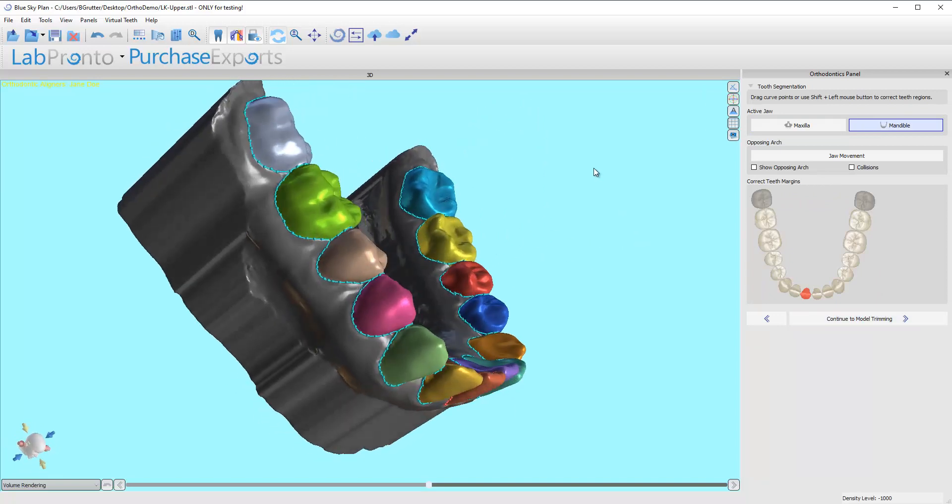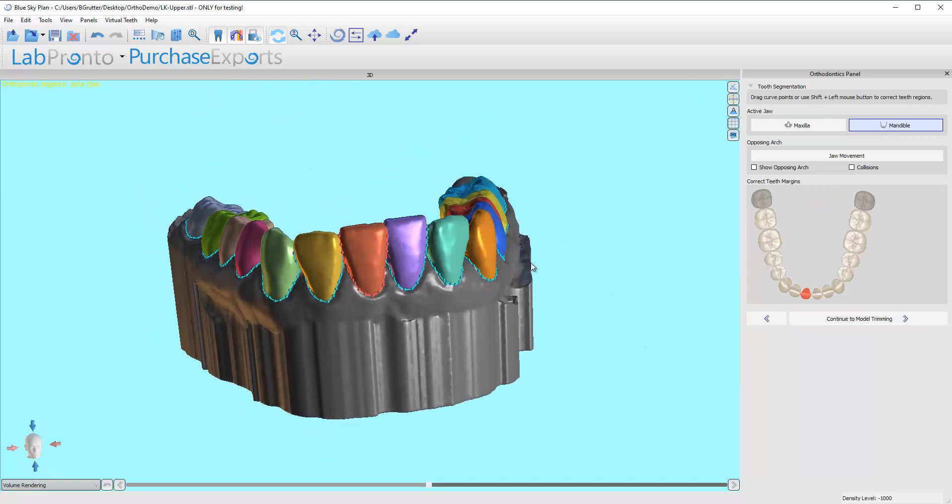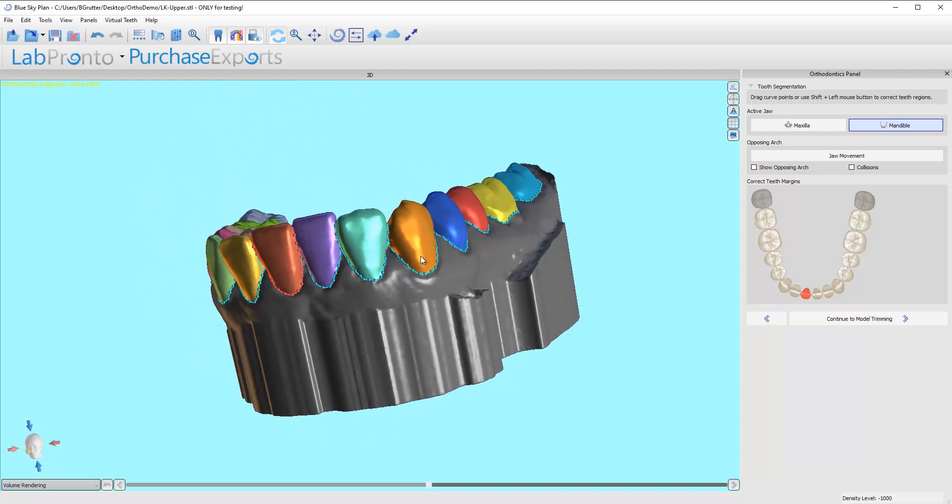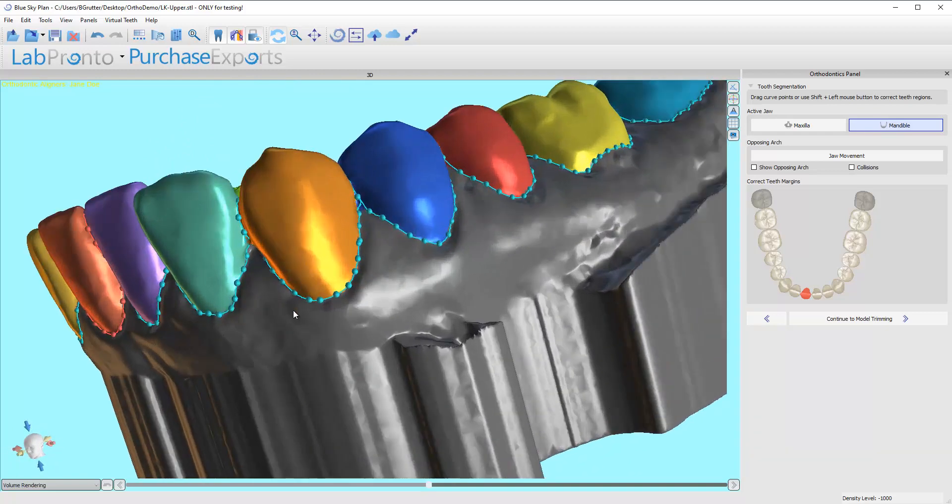And once again, it did a pretty darn good job. I'm not seeing any obvious areas as yet that need to be fixed.